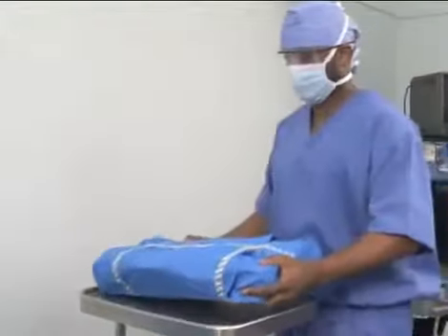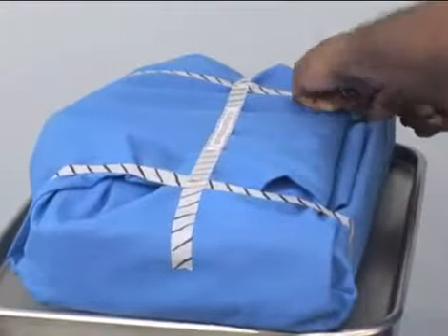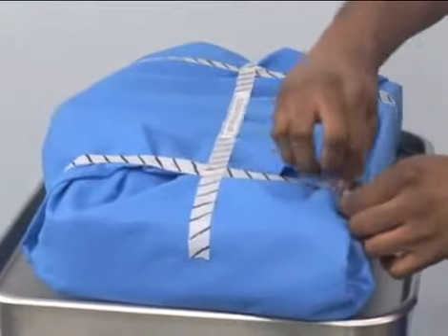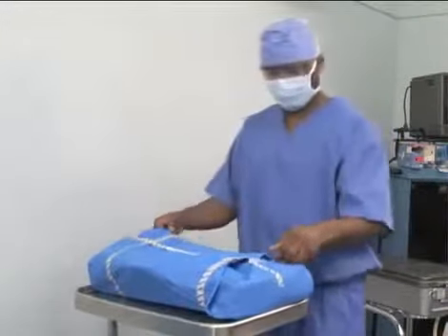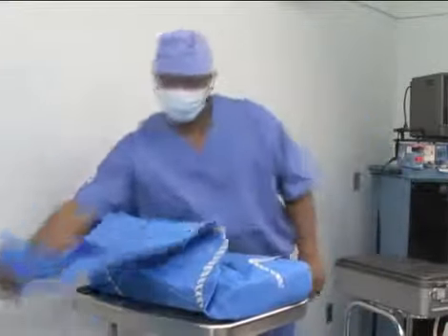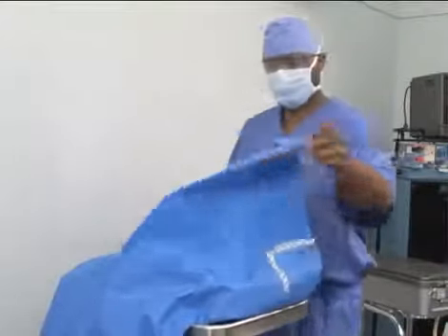The following technique is used by non-sterile personnel to open an instrument tray properly. When opening large instrument trays, rigid container trays, or other heavy equipment, set the tray on a small table and then open in place. Orient the item so that the flap farthest away from the body is grasped first. The flap is opened away from the body and gently pulled down.